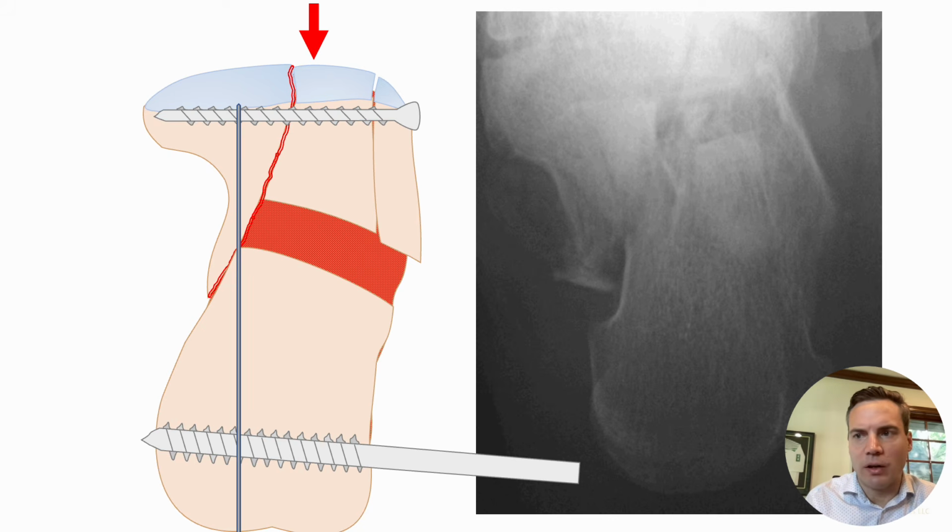We talked about using some artificial bone graft such as cement into that area to act as a void filler and help give some structural support where the bone gets crunched down and we have some, quote unquote, bone loss.